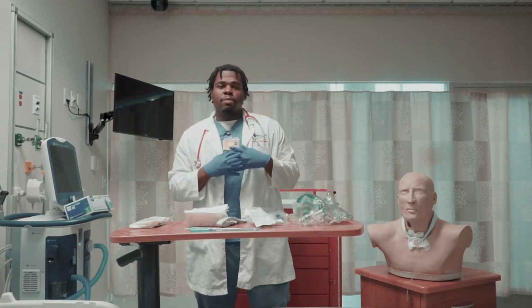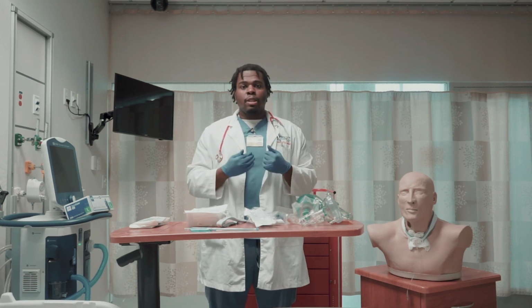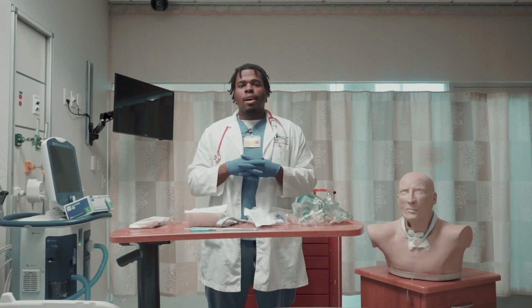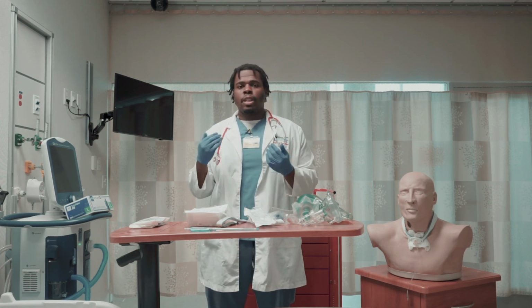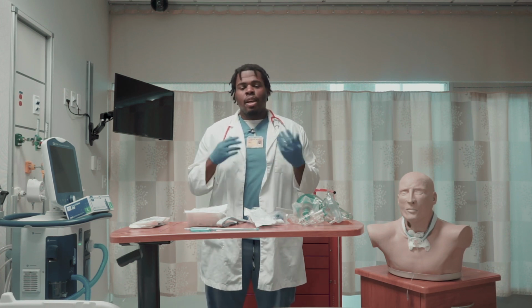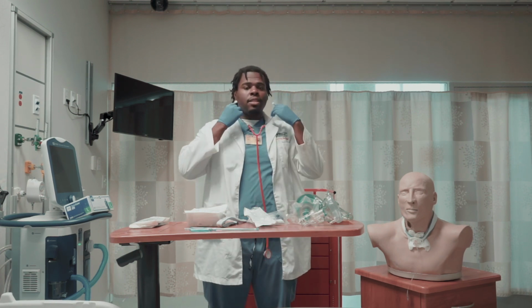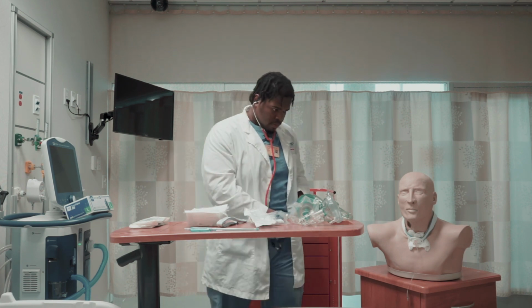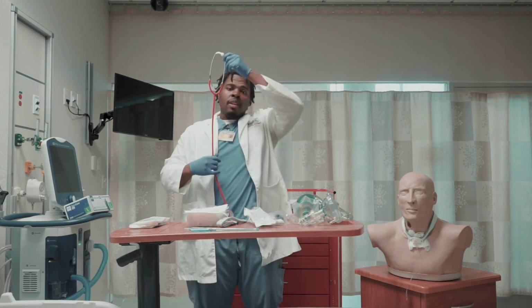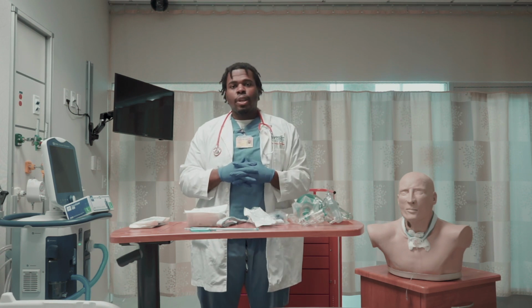Now that I've done that and explained the nature of my visit, I have a side note. When you're explaining the nature of your visit, make sure you explain it in a way where the patient can understand what's going on. After doing that, I want to get his vitals and check for breath sounds. His vitals include heart rate, respiratory rate, and SpO2. And I'm going to auscultate for breath sounds. While auscultating, you could check for airway patency. Now that I've checked his breath sounds, I see there's a need for tracheal suctioning.